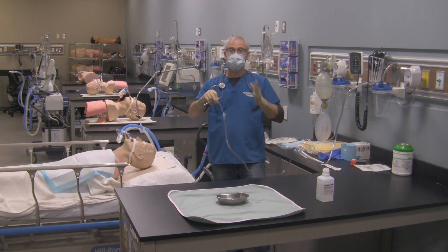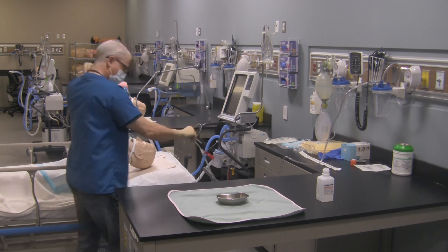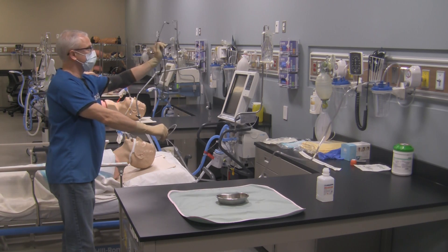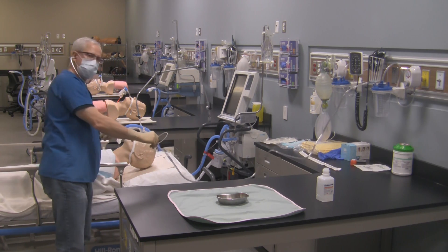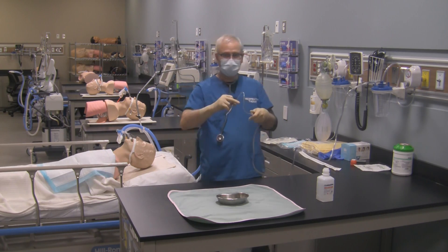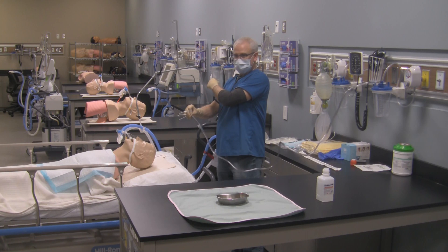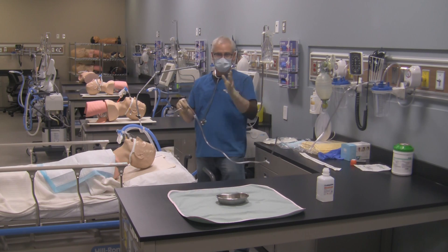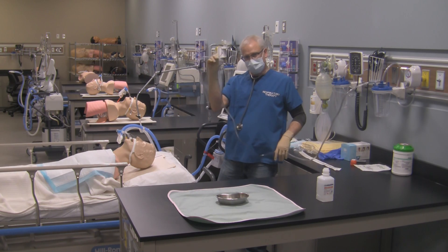Are you done? No — you need to assess your patient to ensure that they're clean. Come over here like so. You'll notice I didn't put my back to the sterile field. Tell the patient you're going to listen to their chest. Grab your stethoscope, put the ear pieces in, and listen to the patient's chest. If it looks like the patient needs to be suctioned again, clean out the catheter one more time, make sure vital signs have stabilized, check the FiO2 on the ventilator — make sure it's back to 100% if needed. Make sure your patient has recovered, check the monitor, and make sure there's nothing abnormal. Tell the patient you're going to suction them out again. Notice how I'm not compromising the sterility of my sterile hand and catheter.